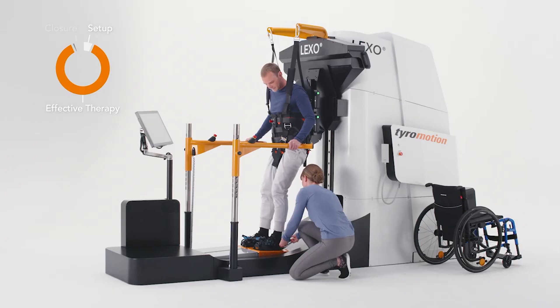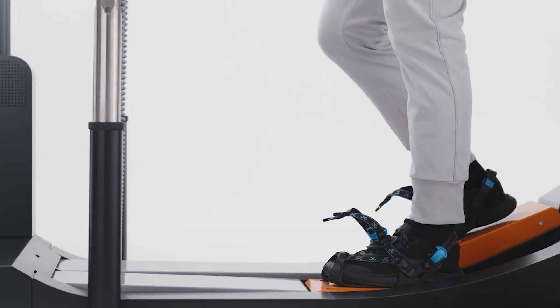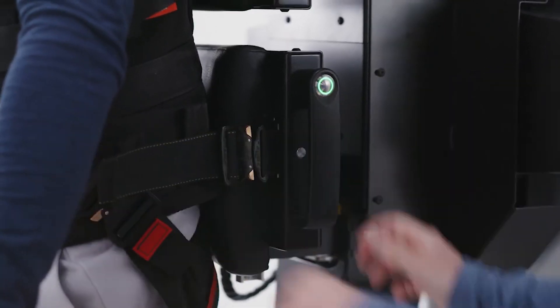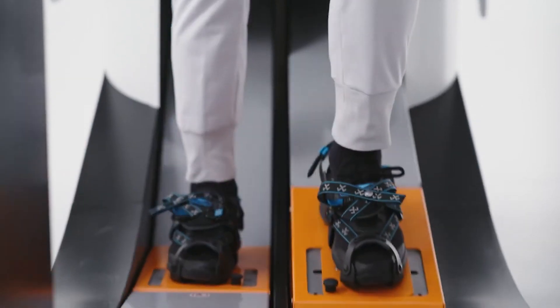The intuitive setup allows the therapist to focus entirely on the patient and their personal rehabilitation goals. Furthermore, Lexo's pelvis plus guidance system can be adjusted seamlessly, which guarantees a physiologically correct posture and encourages a natural gait pattern.